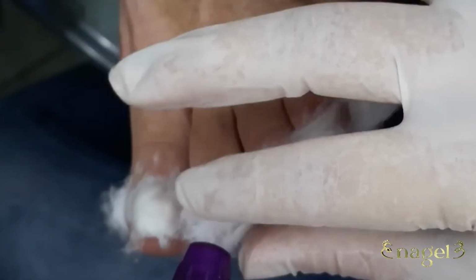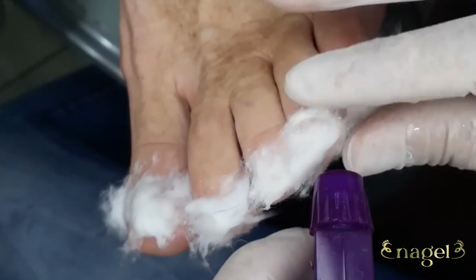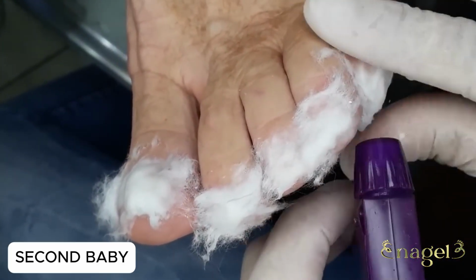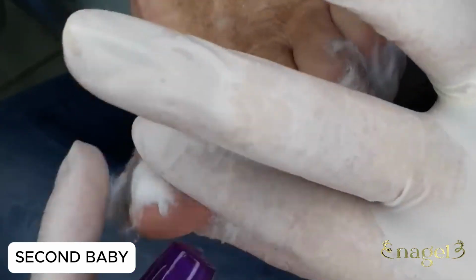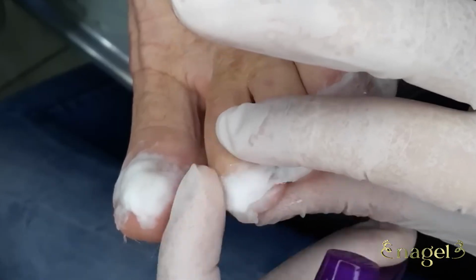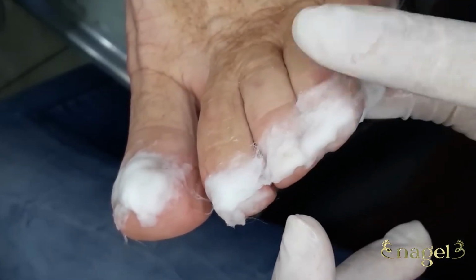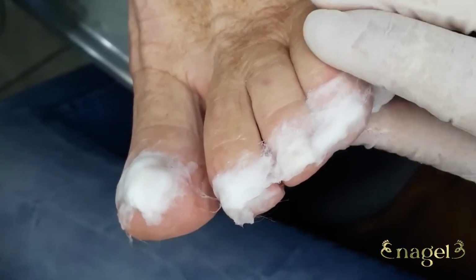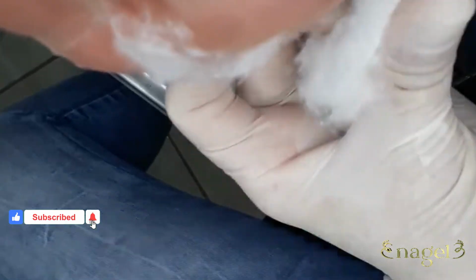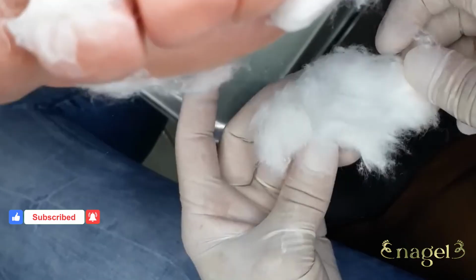Now, the most critical part of the procedure on the right foot, applying the fiber. My mom has been using fiber on her nails for over 10 years because without it, the natural curvature causes constant ingrown nails. The fiber is a technique that corrects the curvature, pulling the nail into a straighter position. Before applying it, I place a small piece of cotton in the nail's corners to protect the skin, as the glue I use is strong and can spill, causing irritation.